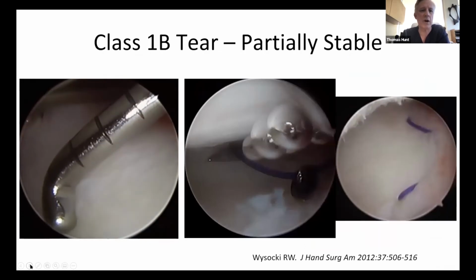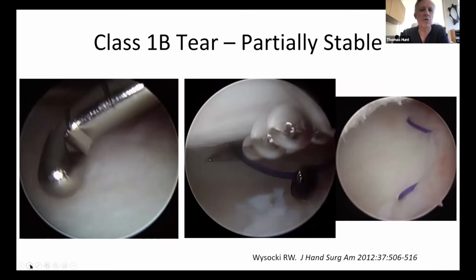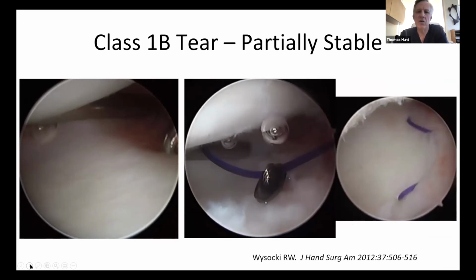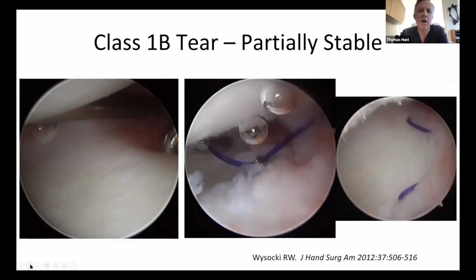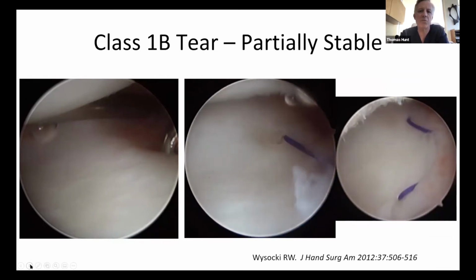And so here's his arthroscopy. You can see us through the 3-4 portal. And then you can get under the periphery of the TFCC, clearly a peripheral tear. Next, please. And here's kind of a standard outside-in repair using 2 needles, very, very standard approach and very successful, but a capsular type repair. So one in which I would utilize in a situation such as this, mild instability and associated pain. You see his final result on the far right. Next, please.